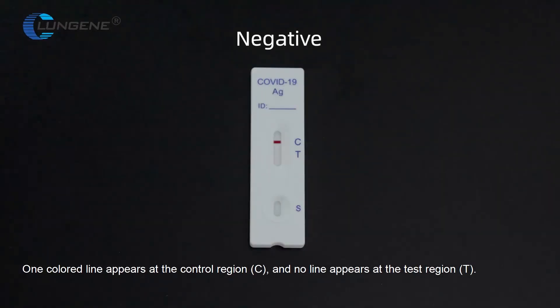Negative: One color line appears at the control region and no line appears at the test region.